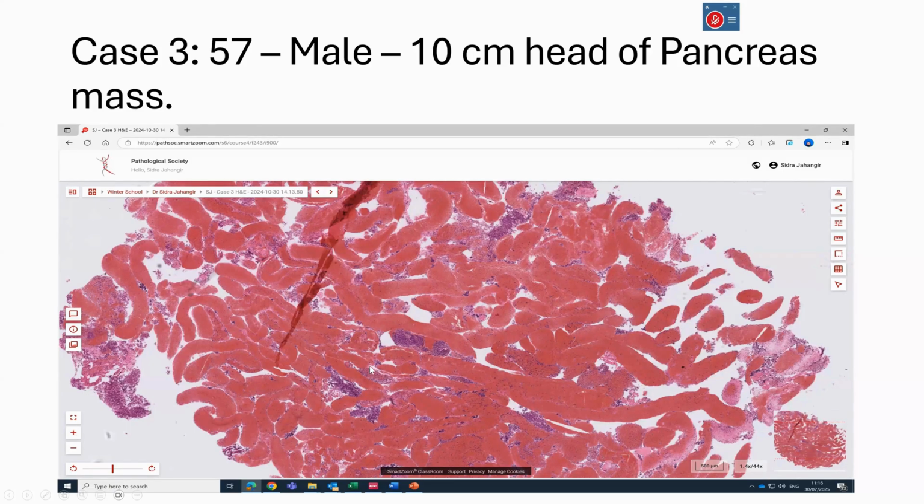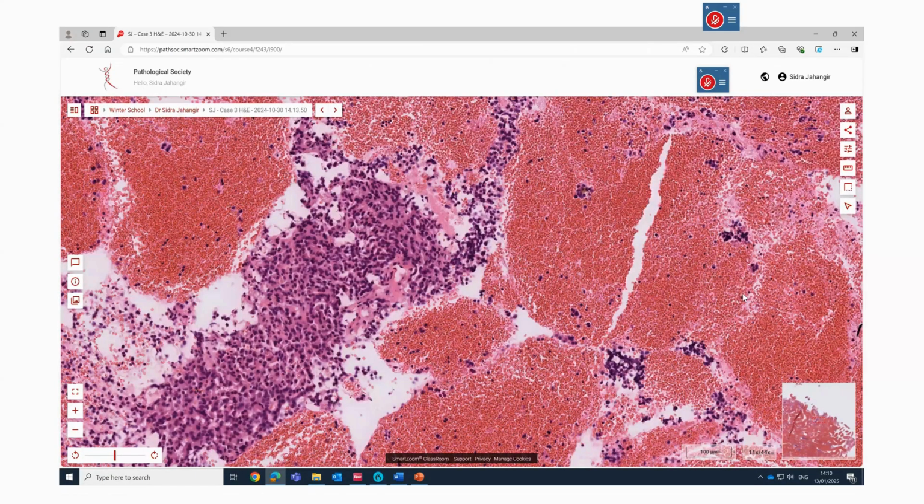Most of the time what we are getting is either GI contaminant epithelium from the stomach or duodenum, depending upon the approach the gastroenterologist is using, or a lot of blood and fibrin along with the tumor cells. So we have to triage and handle this material very carefully, not to waste anything. Among the blood and fibrin clots, we have these tumor areas.